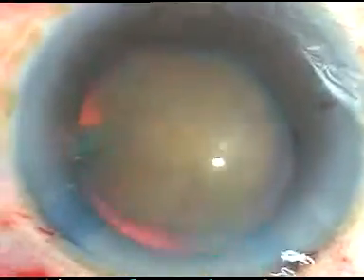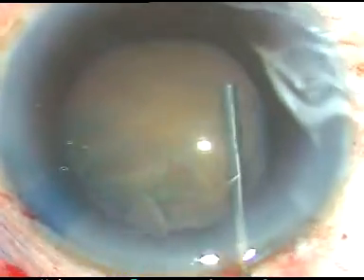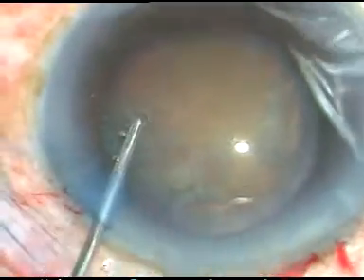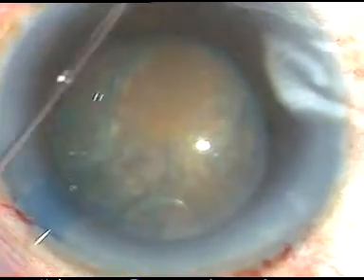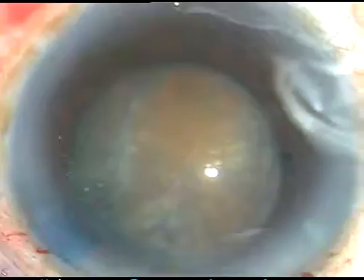Now, hydrodissection. Hydrodissection was a tricky business in this case. I did hydrodissection at several points, but still the rotation of the nucleus was not satisfactory. I tried to rotate the nucleus, but it didn't rotate nicely. I did hydrodissection at some more points, and ultimately I gave up — I could not rotate the nucleus nicely.